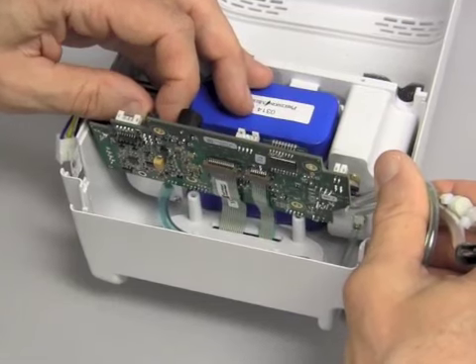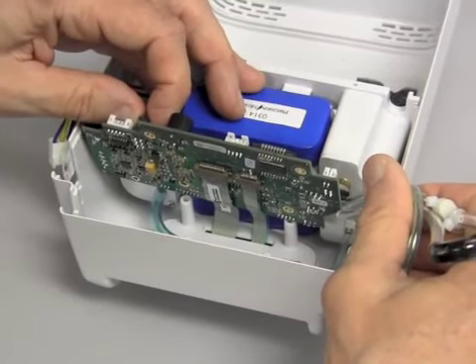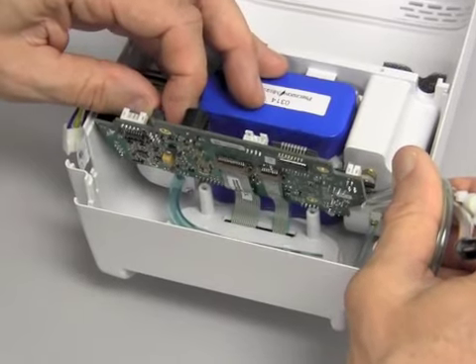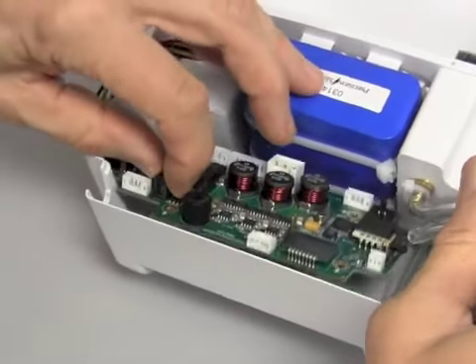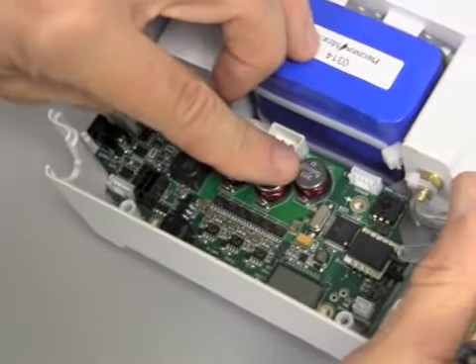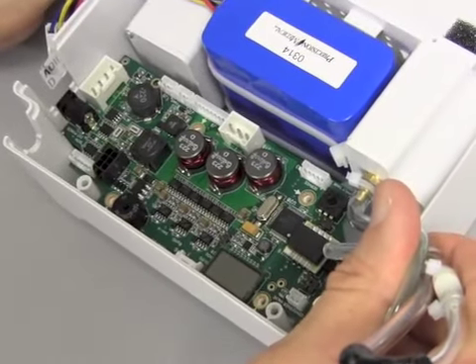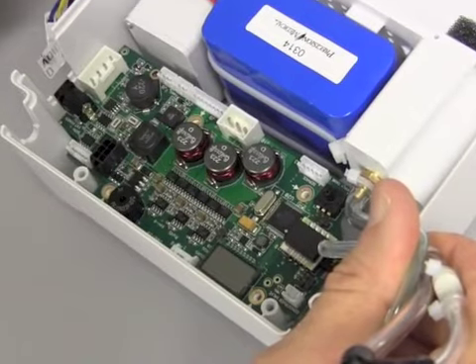This shows that the ribbon cables are back in place into their corresponding clips, and now you're ready to lay the board flat into the POC case. Once this is done, then you can reinstall the 4 screws that hold the board in place.